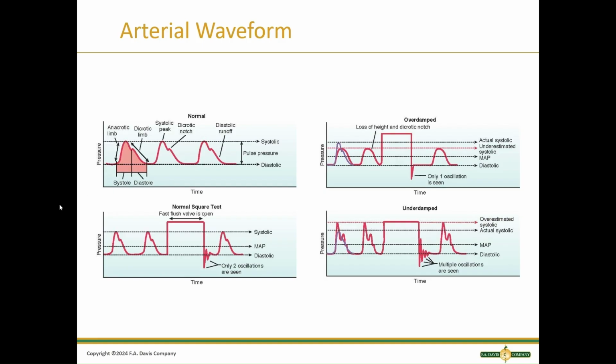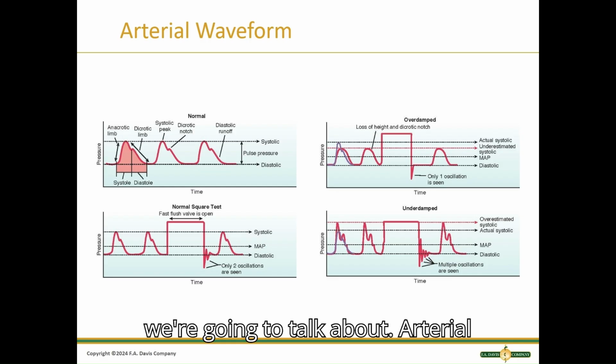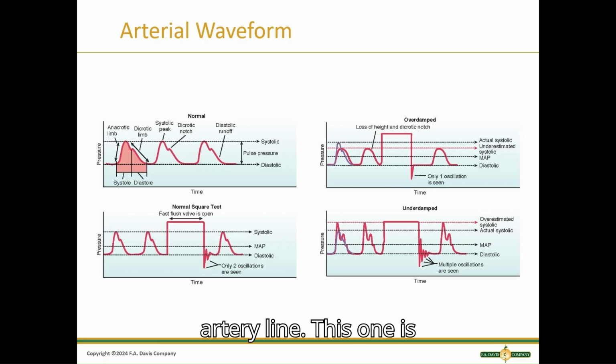As you see in this first picture, we have a nice even waveform. It has that little notch, which we call the dicrotic notch. We want to see that. That is giving us a nice even waveform.